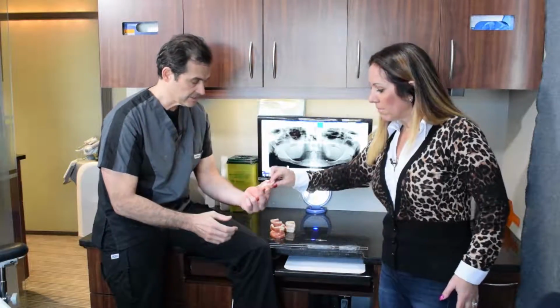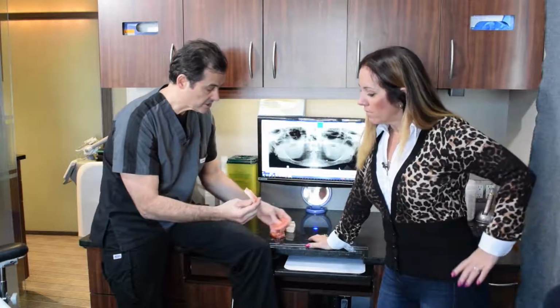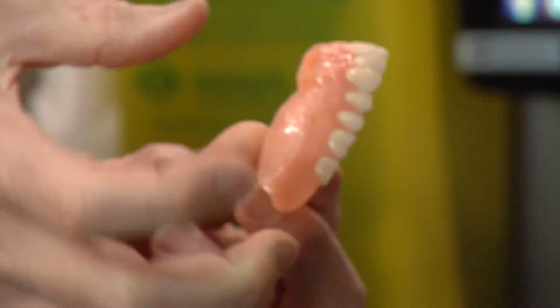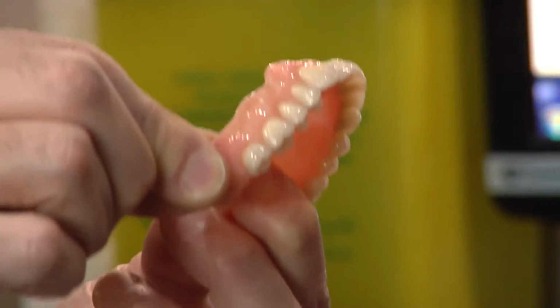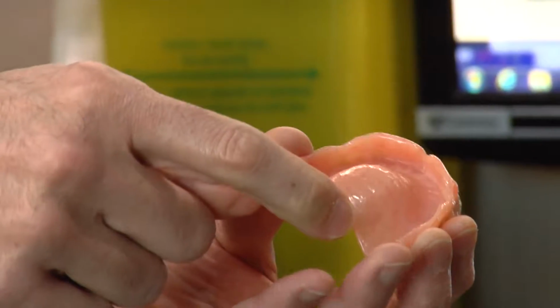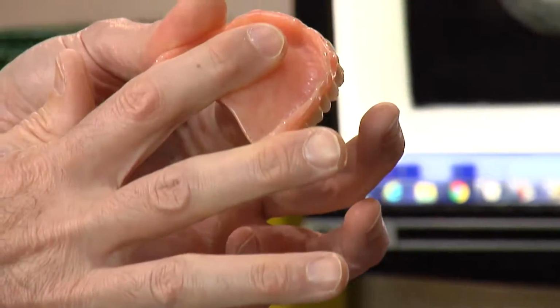And so what happens is the laboratory who's going to actually fabricate the denture, we send them all the measurements of the jaws, so we take impressions and we send measurements, and then the lab will fabricate for us something like this. Basically it's a pink plastic, so we call that a resin, an acrylic resin. These individual plastic teeth are set into this plastic resin base. That's a denture. The important thing to understand about dentures is that you can't cut away the whole palate because it's just plastic, it'll break. So they have to cover the whole roof of their mouth if it's an upper denture.